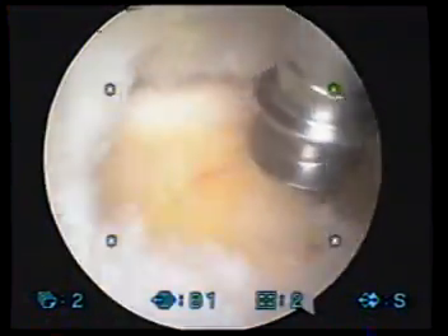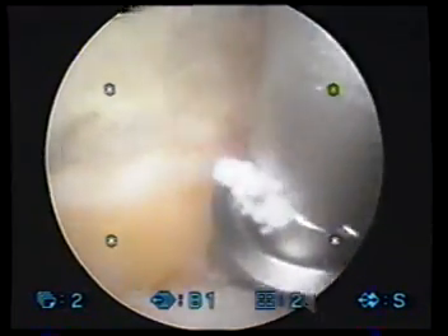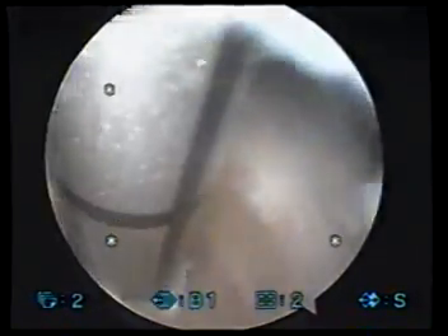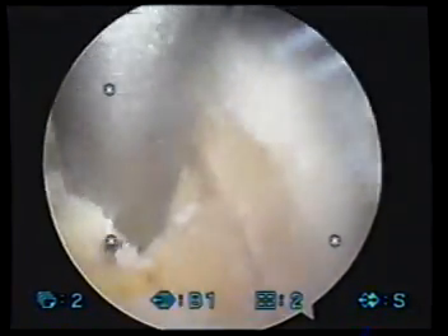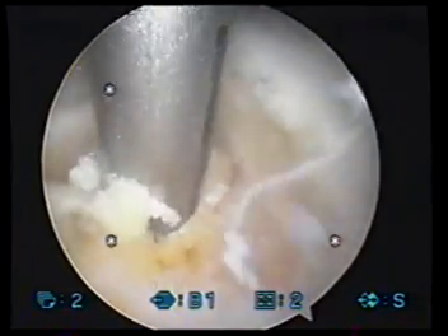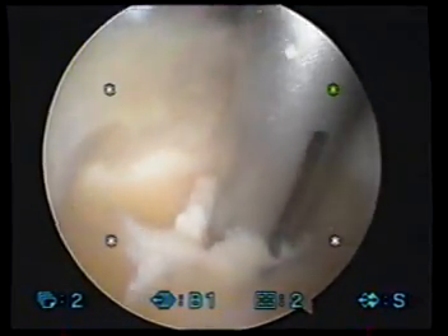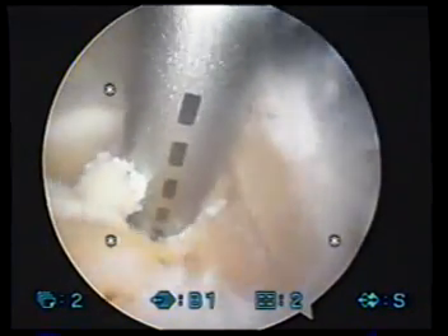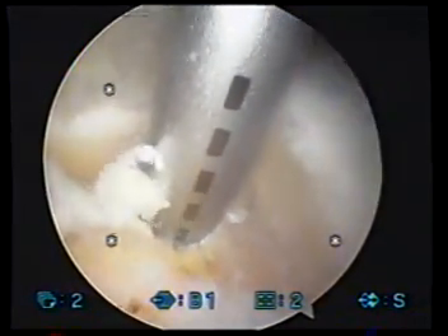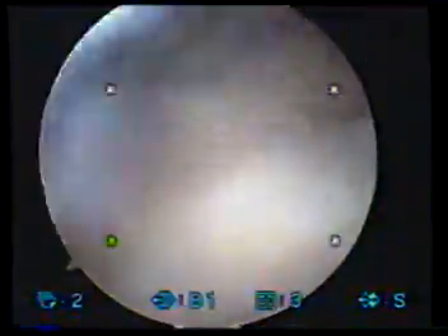There you see your first anchor going down deep inside the bone. The way these anchors work is they have a strong suture attached to them. That strong suture works like a drywall anchor — it holds a picture on the wall. We put those down deep inside the bone. We're going to put two of these anchors in today to hold your rotator cuff back together. Once they're buried deep inside the bone, you'll see we extract the screwdriver. And once we do, you'll see the stitches sticking out through the surface of the bone. Now what we're going to do is use some specialized knots to tie.